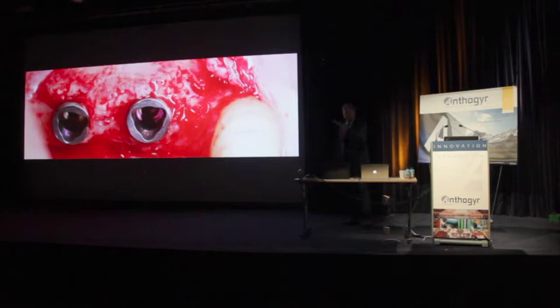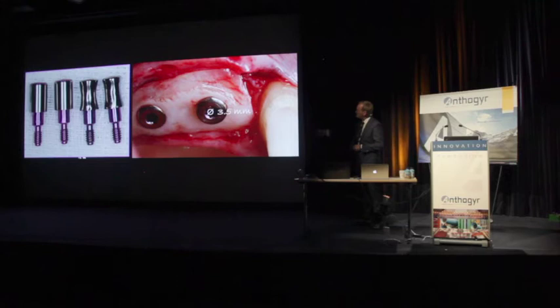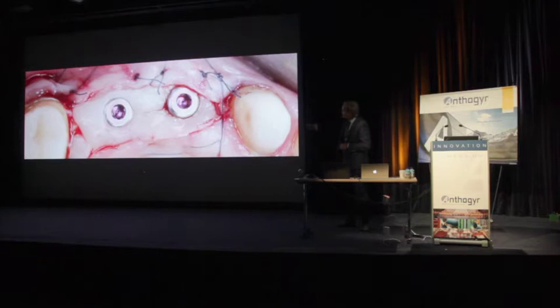of the bone augmentation. Then I went to the donor site in the palate, find a thick piece of tissue, make two very small perforations, and I place them on these modified healing abutments. Also the buccal portions, you see the modified healing abutments, concavities, I have more space for the soft tissue, and the buccal part is de-epithelized, so I can suture the other part of the flap buccally.